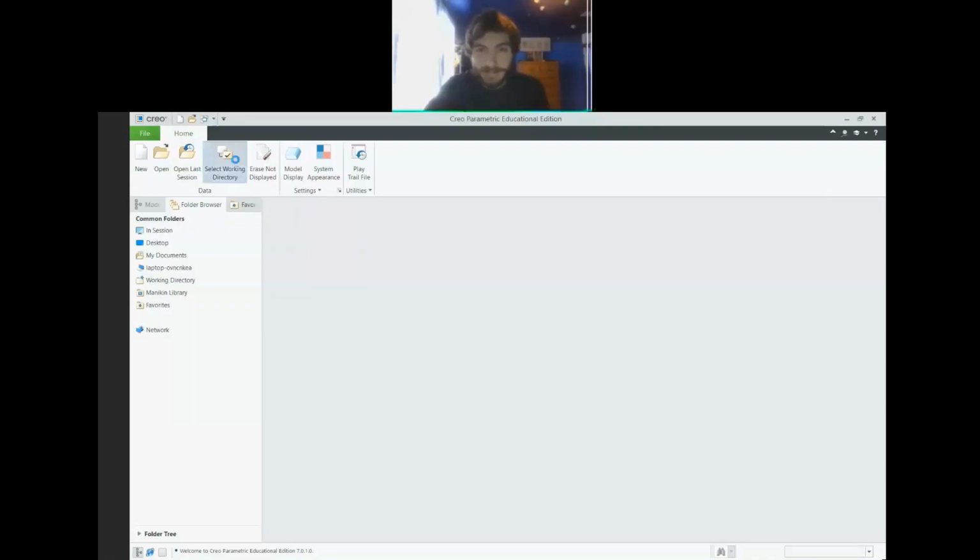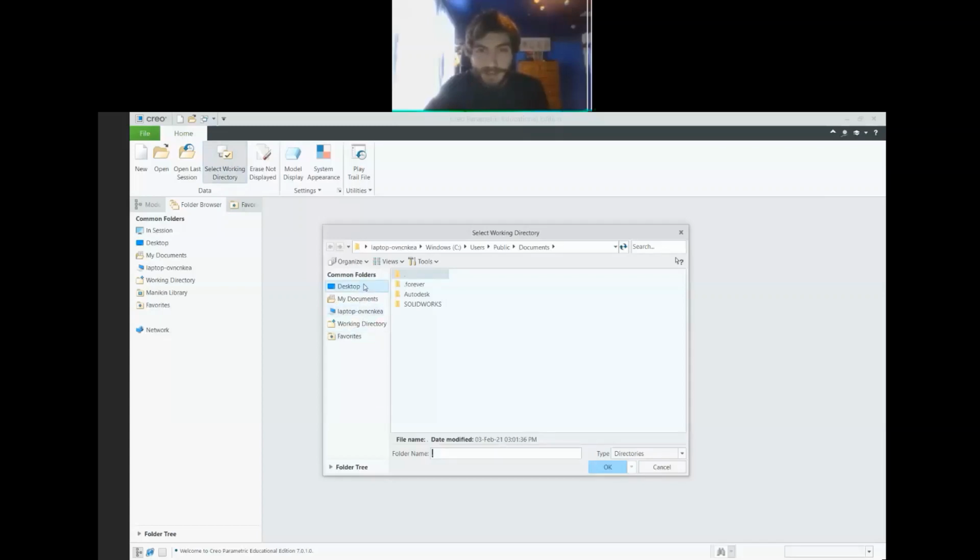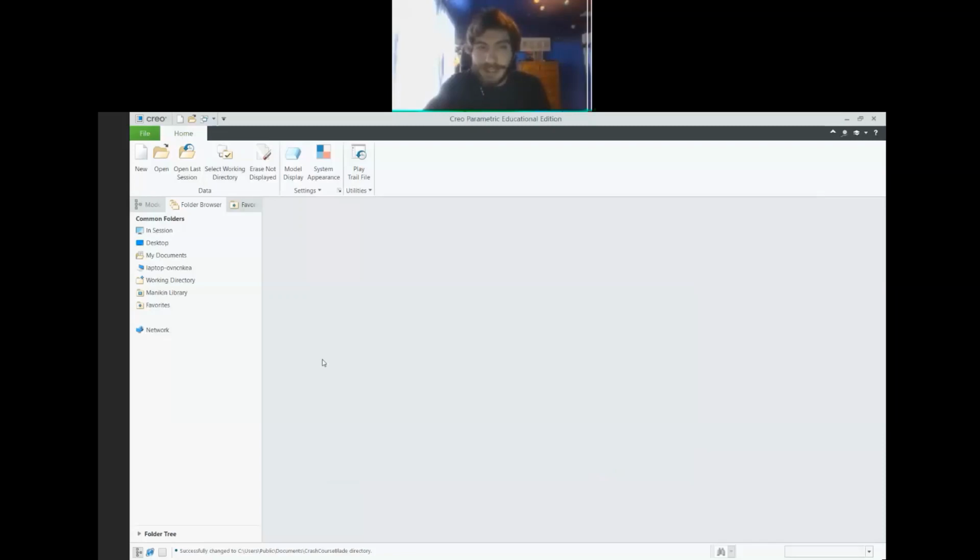So we're going to go ahead and select our working directory. Documents is fine. I'll create a new folder and we'll just call it Crash Course Blade. Once you pick whatever folder you want, you press OK. This is where all of the things we do for the entire time we have Creo open are going to be saved by default. If you don't do that, you won't be able to get past versions of your file.